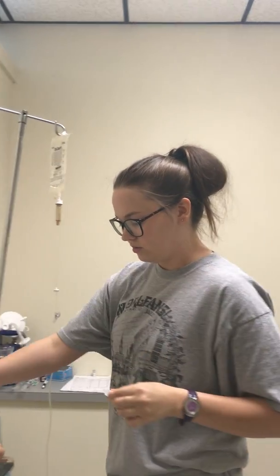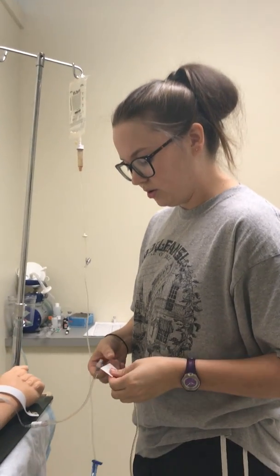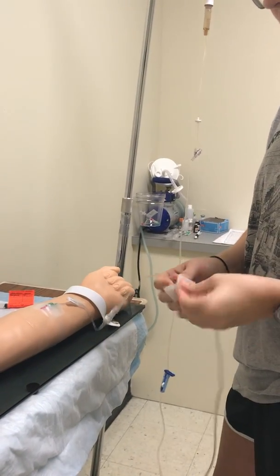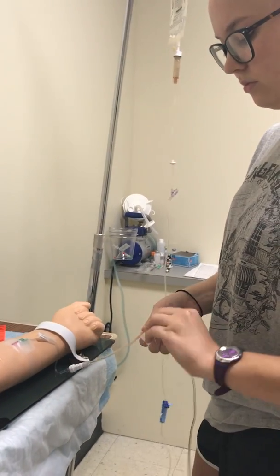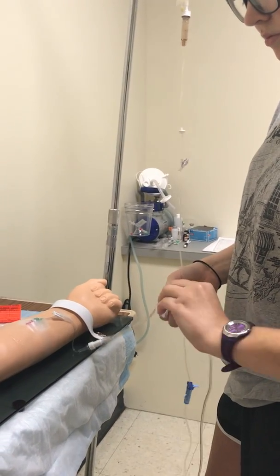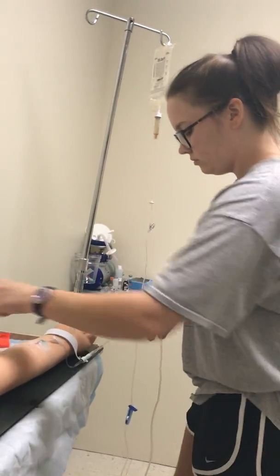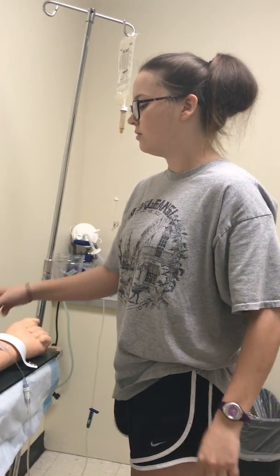Getting my alcohol swab. I'm going to get the hub and I'm going to rub this for about 15 seconds. Okay, put it down, making sure it stays sterile.